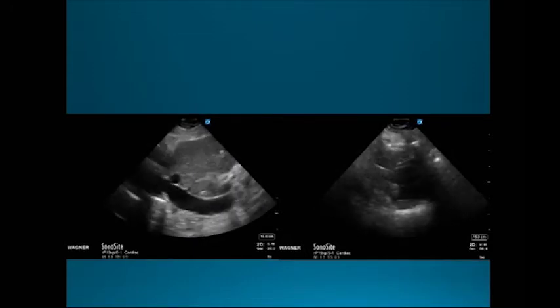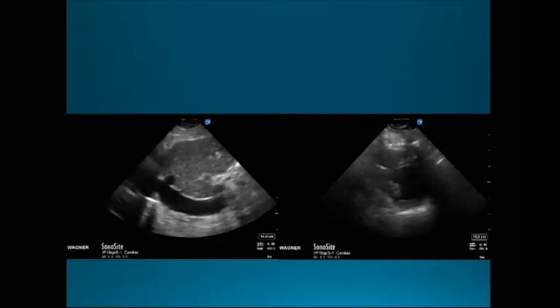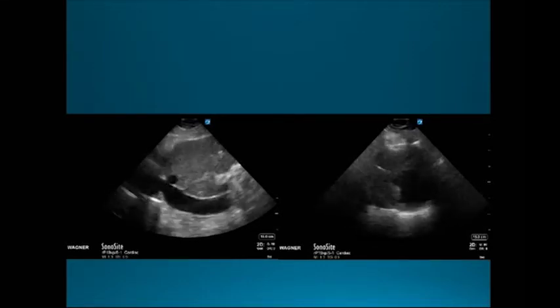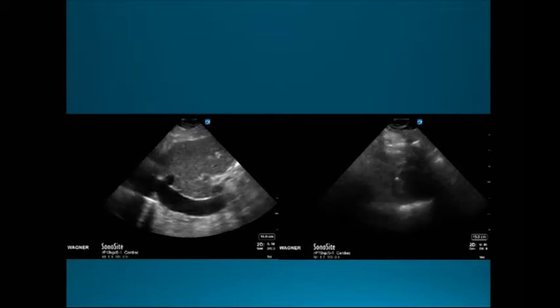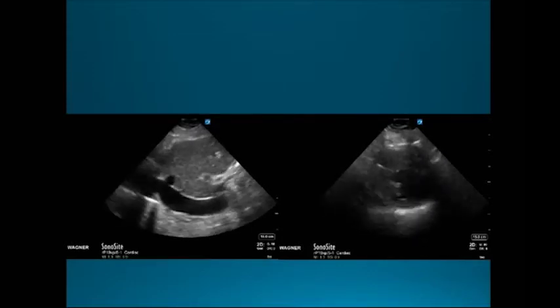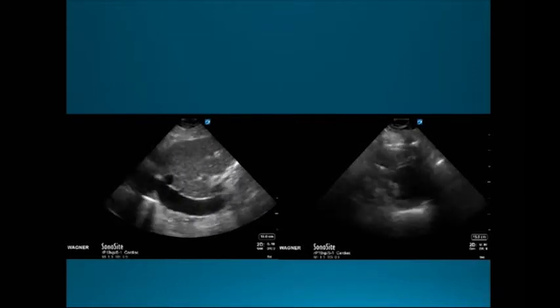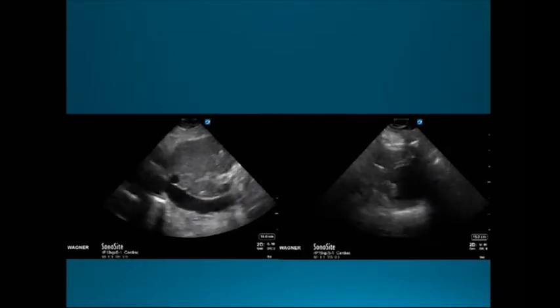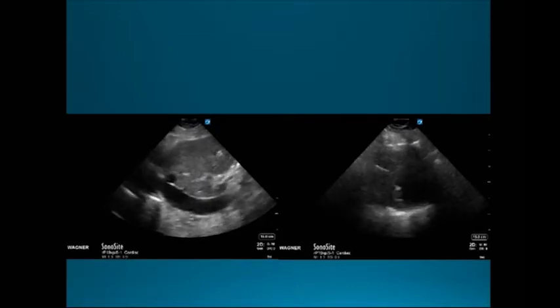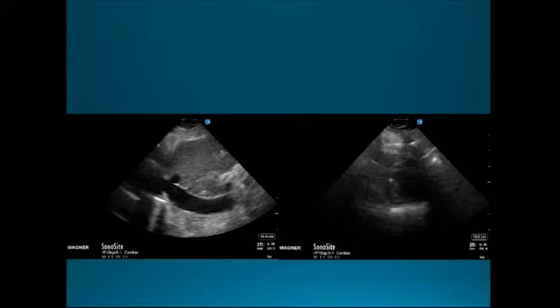This is a heart in cross section. This is her left ventricle, and what you're looking at is this sort of concentric squeeze of the heart. And her squeeze is relatively preserved there when I took a look at it. And recognizing that this big IVC is from her diastolic dysfunction, and also because of all the fluids that she got. So now if she's hypotensive, the answer is not more fluids, right?